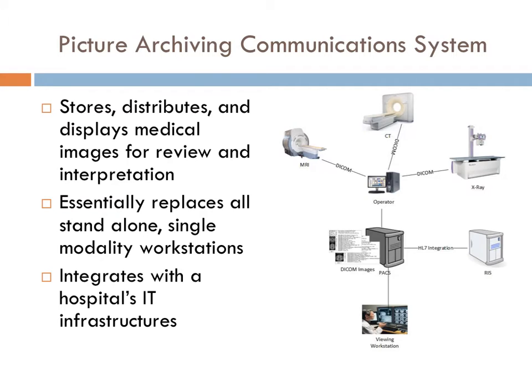A PACS is a picture archiving communications system. So it stores, distributes, and displays medical images for review and interpretation. Everyone uses this, from the radiology tech to the radiologist to the PACS manager to the radiology film staff, but everyone essentially has to access the PACS at some point. It replaces all standalone single modality workstations, and it integrates with a hospital's IT infrastructures.